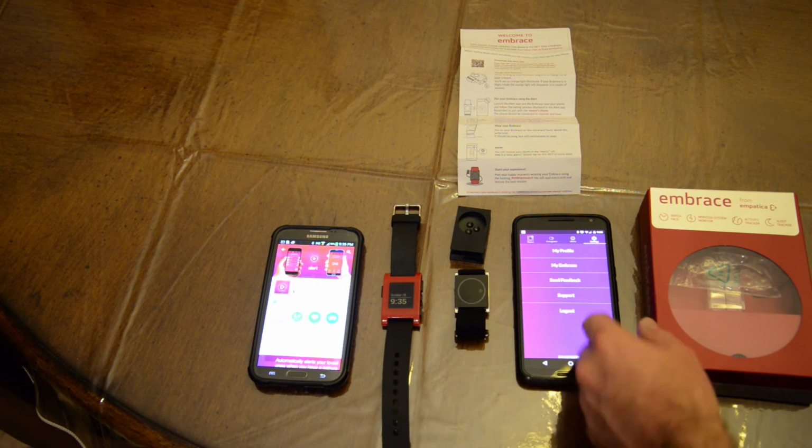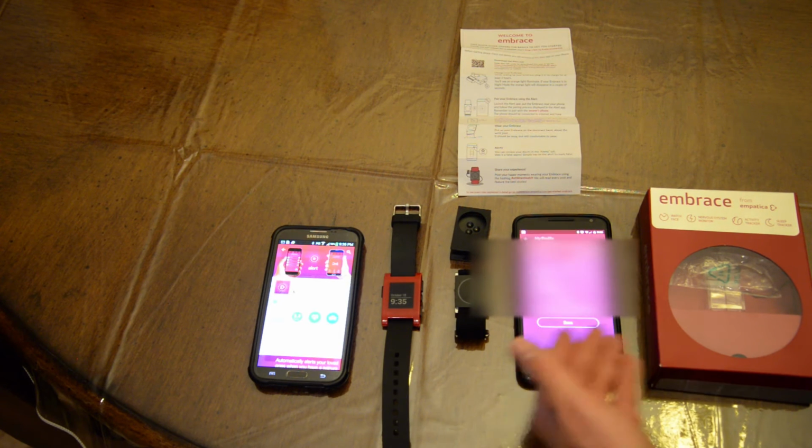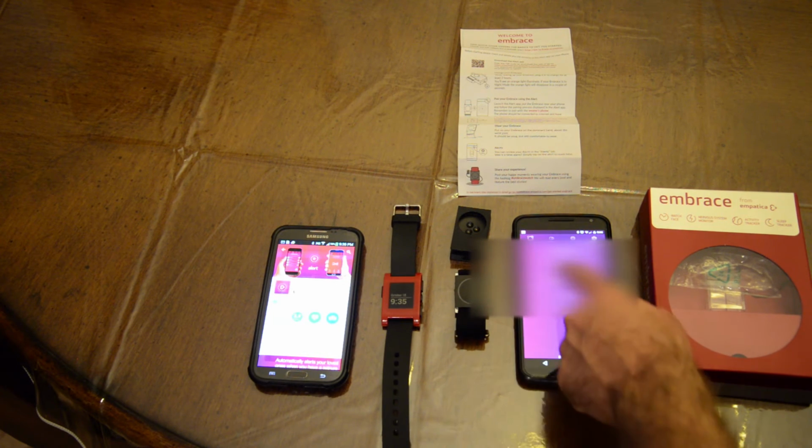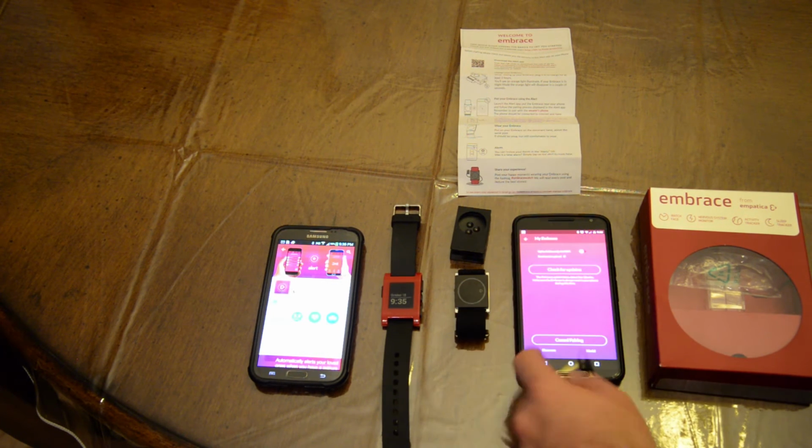The profiles are pretty simple. My profile just pretty much shows you what your son is. You can save a picture. I had a picture, but I uninstalled it and I had to redo it. My Embrace, check for updates.